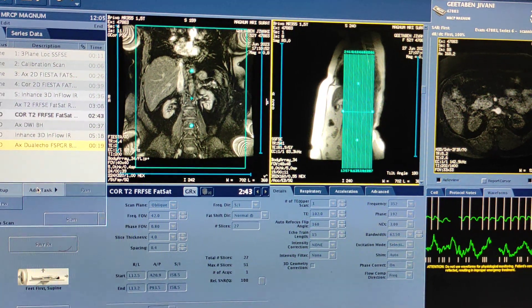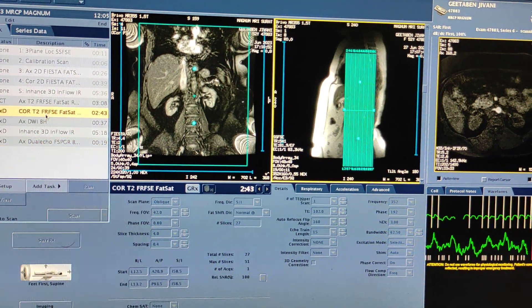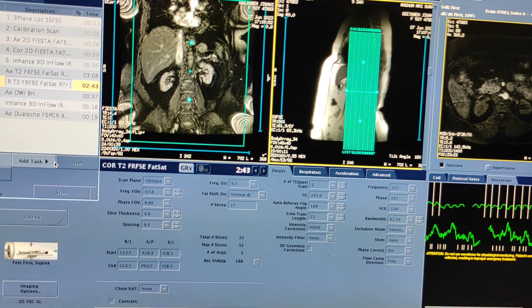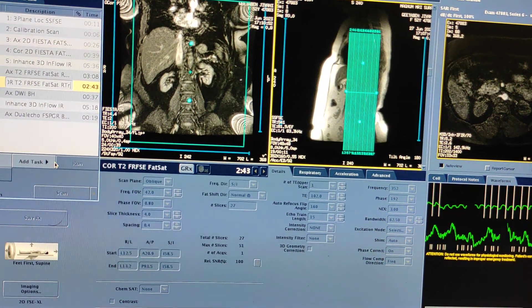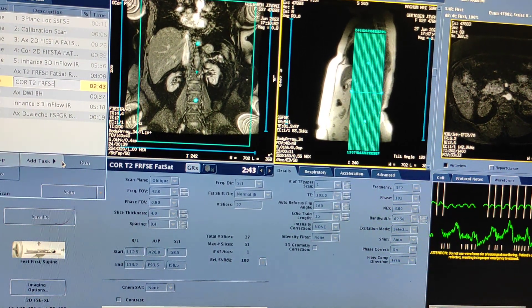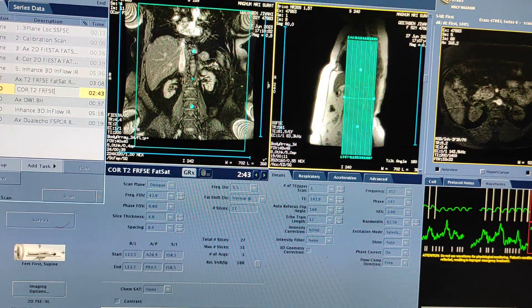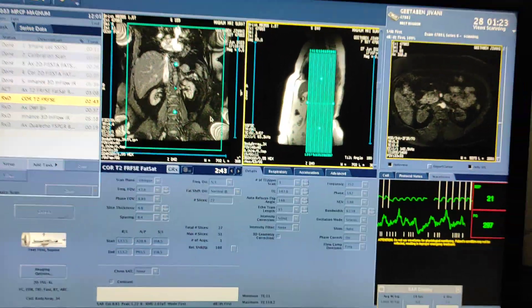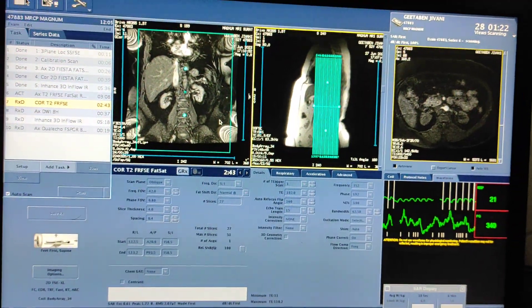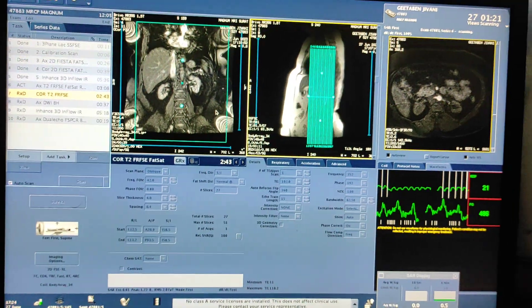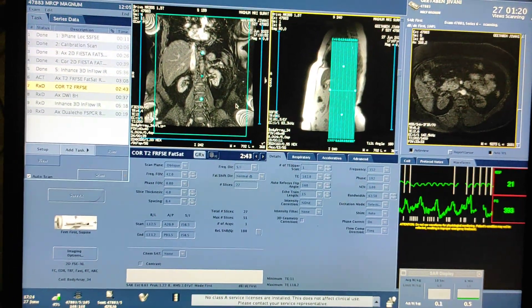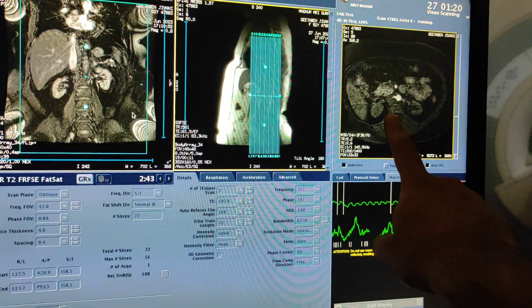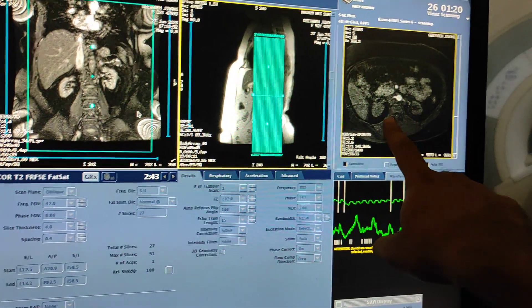Now axial fatsat T2 is going, coronal T2 without fatsat, axial diffusion, and axial dual echo are all in the queue. This is how you do renal angio — this is a very simple protocol. The non-contrast sequence is the main sequence to diagnose the renal arteries.